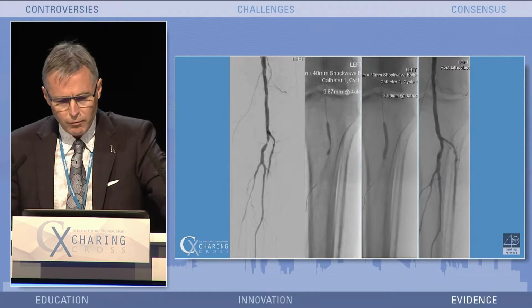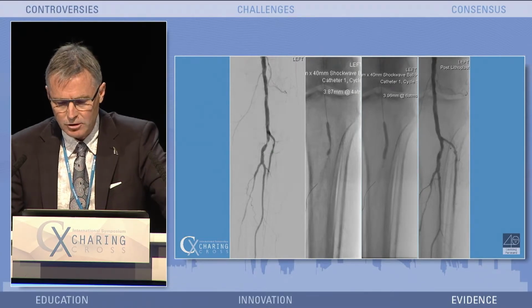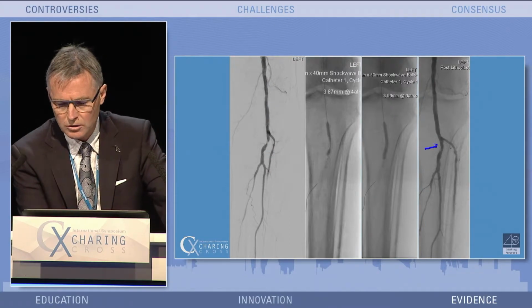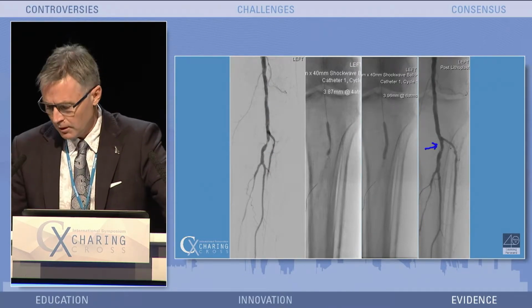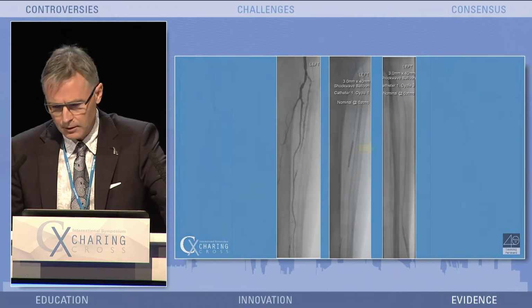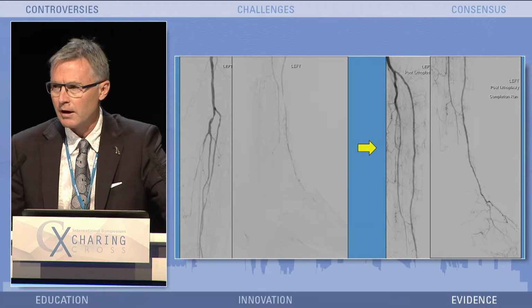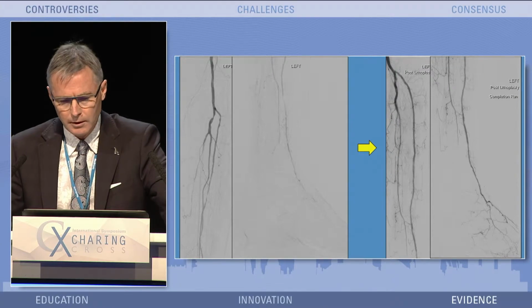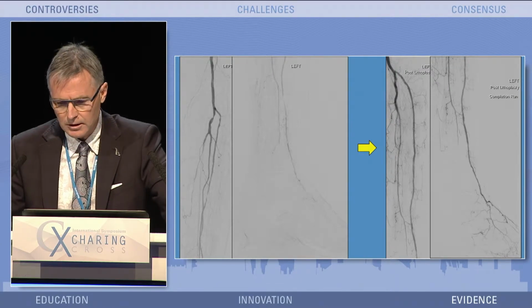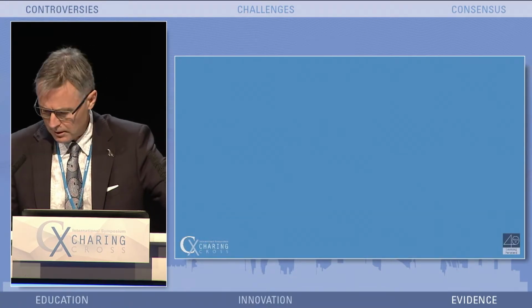There you can see that we've performed intravascular lithotripsy on the tibio-peroneal trunk. That opened up very nicely, and we got a good angiographic result with a minimal residual stenosis. This is again a lesion you would often think you'd need a balloon expandable drug-eluting stent to treat. And then right through that anterior tibial artery, we performed intravascular lithotripsy. And here is the before and after that we achieved with this purely catheter-based strategy for the below-knee arteries, with excellent results.